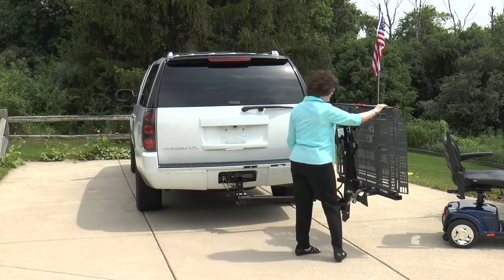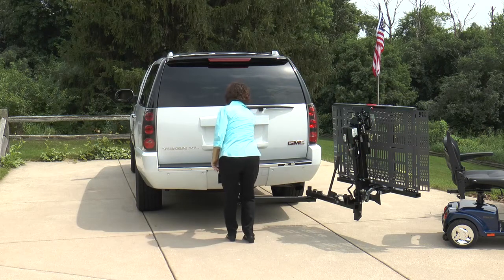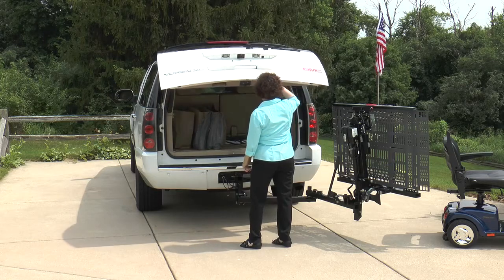Bruno's Outsider allows you to keep all your interior seating and cargo space, and the popular swing-away option allows you to quickly rotate the Outsider for rear hatch access.